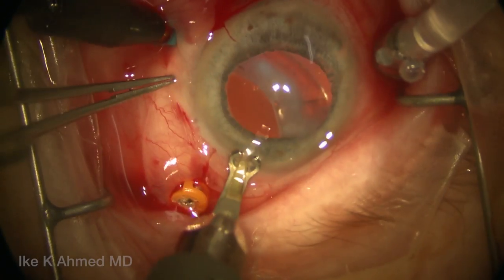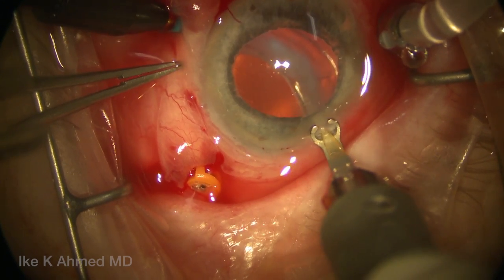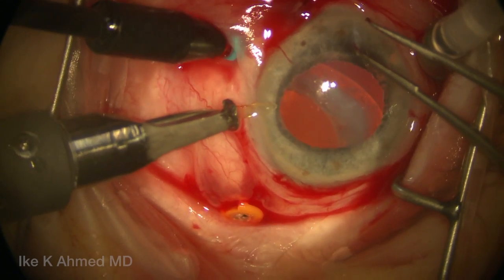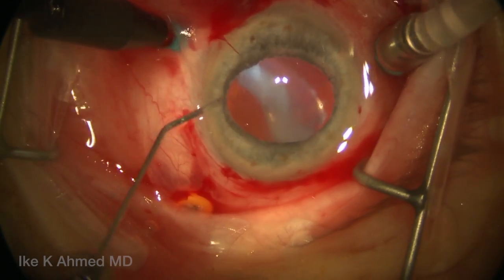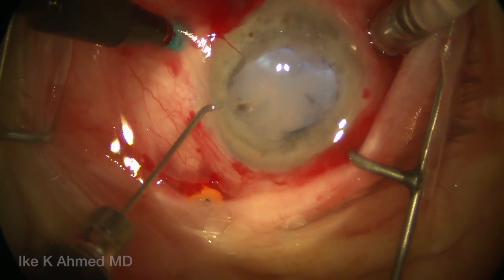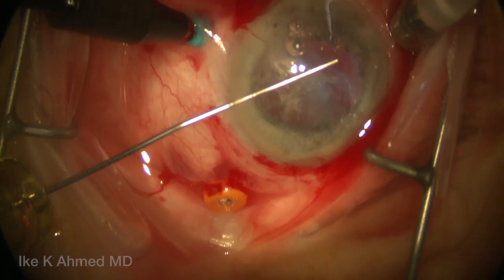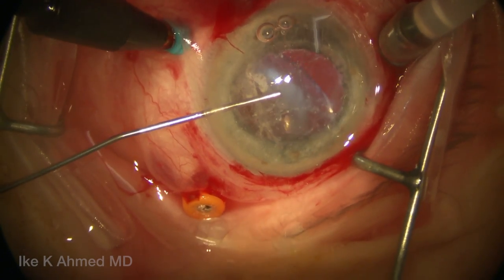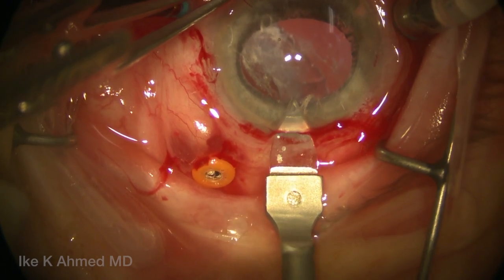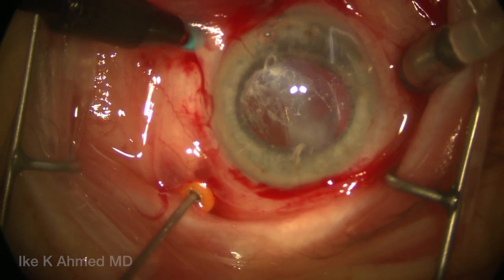So now we have three ports placed within the vitreous cavity. We're going to make a 6 mm corneal limbal groove in anticipation for our corneal incision, and a couple of incisions placed in the peripheral cornea. Some intravitreal kenalog is injected to visualize vitreous — very helpful to ensure we can visualize vitreous — and then followed with some dispersive viscoelastic to protect the cornea. Having the infusion placed in the posterior quadrant helps to prevent turbulence in the anterior chamber.